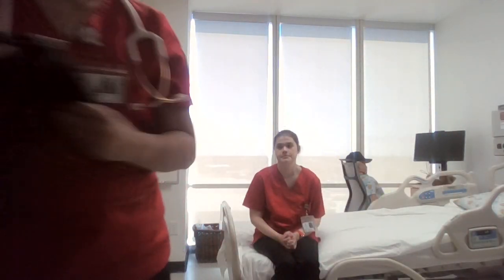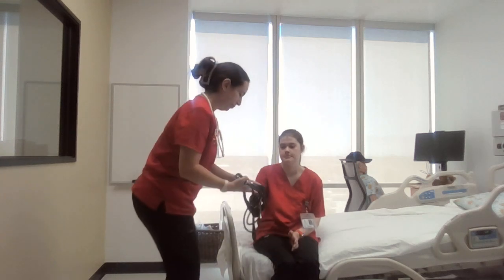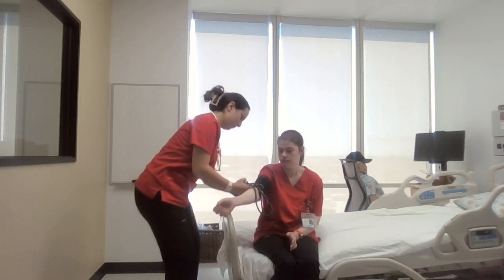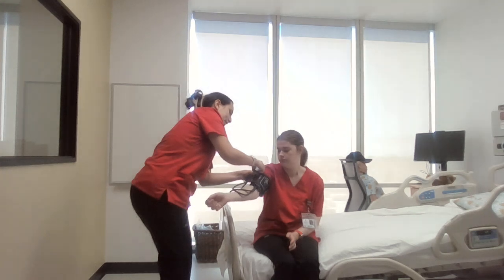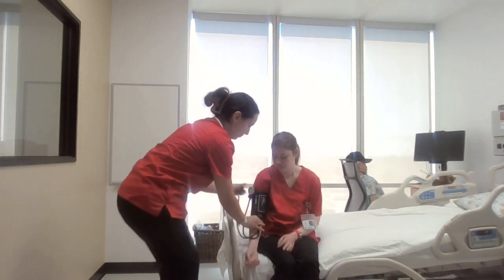And then I will perform vital signs. I'll start by doing blood pressure via the 2-step method. I'll palpate the brachial artery until I no longer feel the pulse.